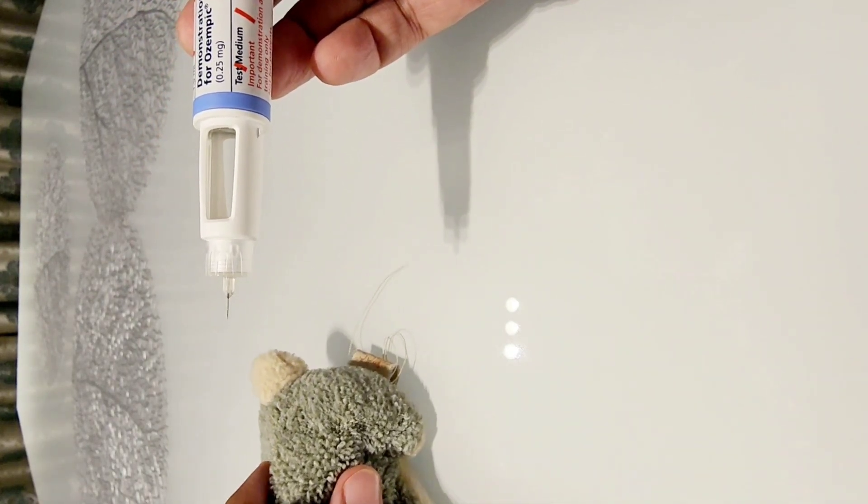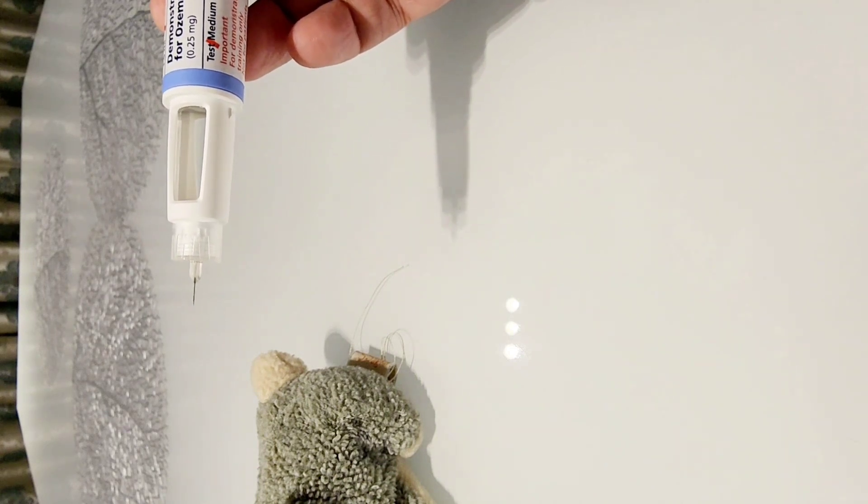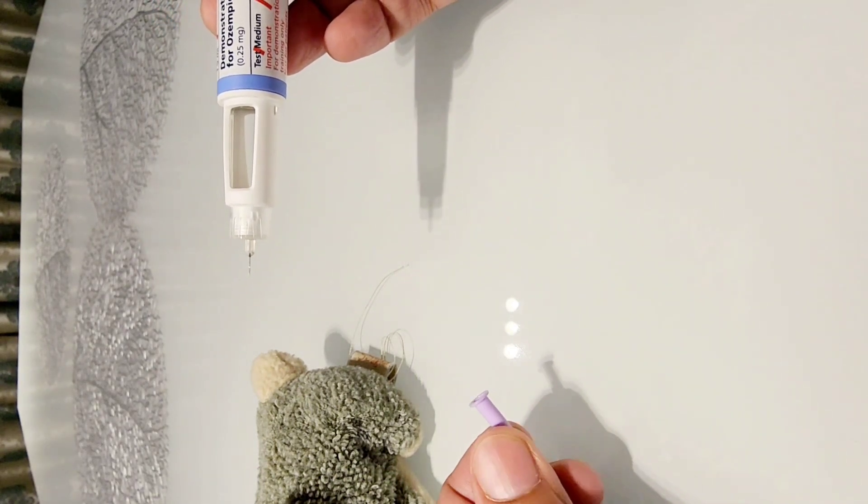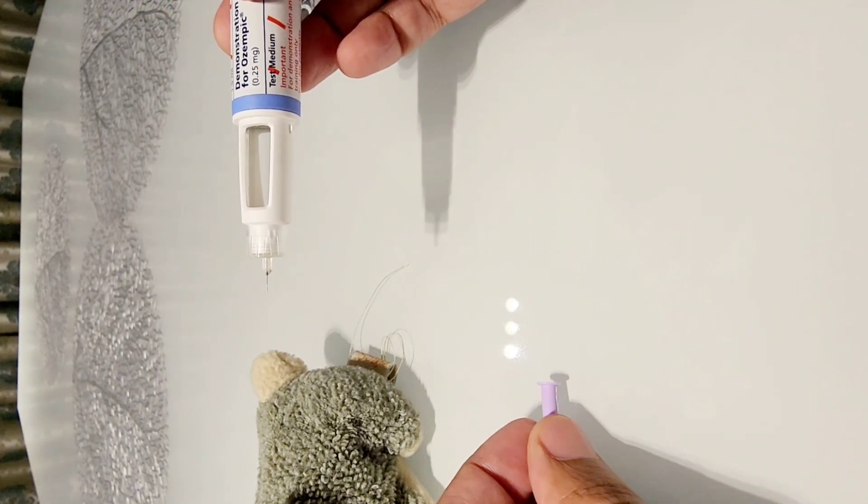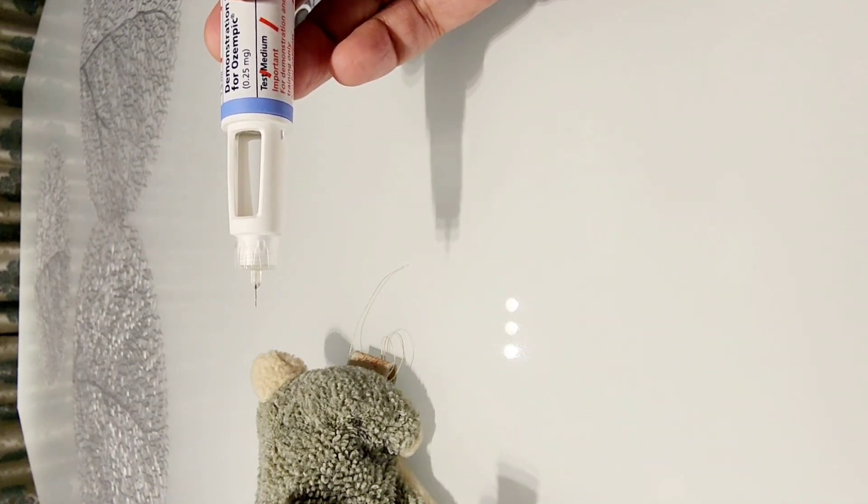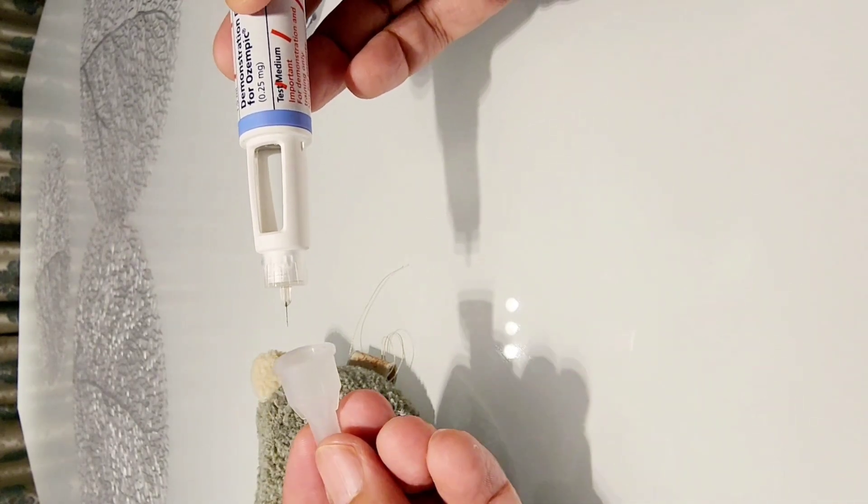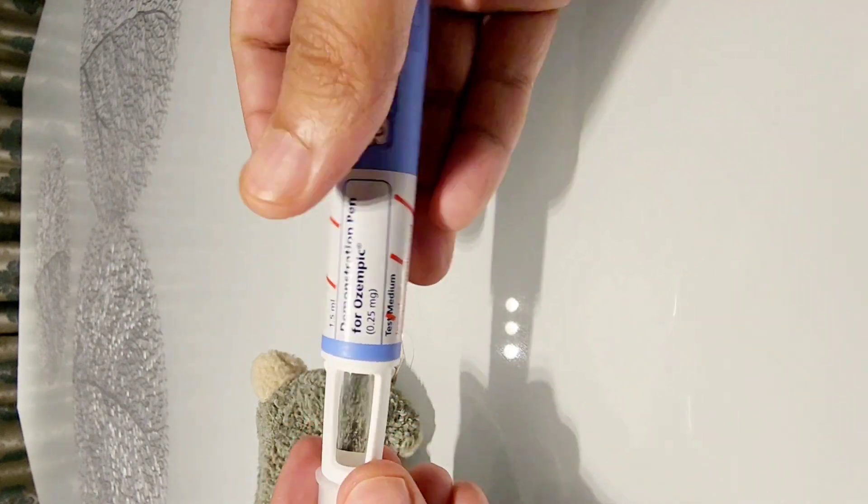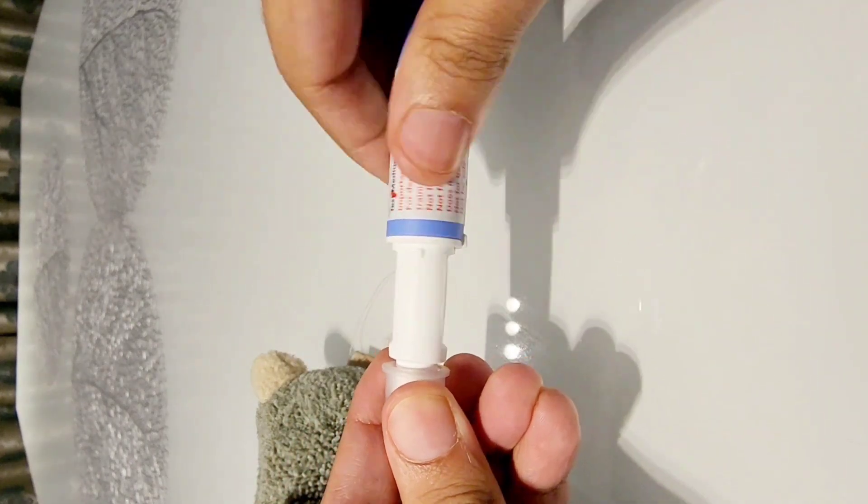And you can just remove the needle. Every time there should be a new needle, do not put this small protective sheet back on because it is a hazard for pricking yourself. Just use this bigger cap to remove the needle and throw it away.